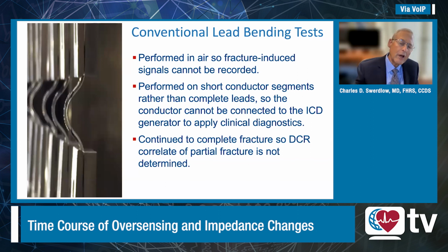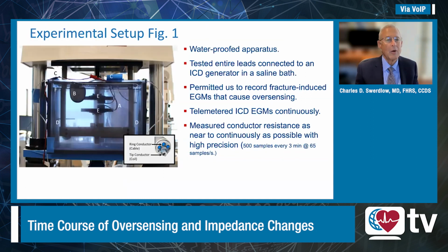Now, to overcome these limitations, let me refer to the slide that's up now, which is figure 1 in our paper. To overcome these limitations, we waterproofed the testing apparatus to bend leads, and then we tested the entire lead, not just a little segment of conductor, and then we connected it to the ICD generator so we could record telemetered signals.